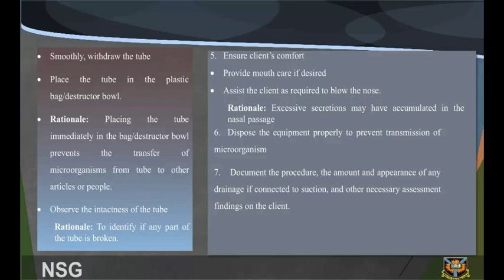Ensure client's comfort. Provide mouth care if desired. Assist the client as required to blow the nose. Excessive secretions may have accumulated in the nasal passage. 6. Dispose of the equipment properly to prevent transmission of microorganisms. 7. Document the procedure, the amount and appearance of any drainage if connected to suction, and other necessary assessment findings on the client.